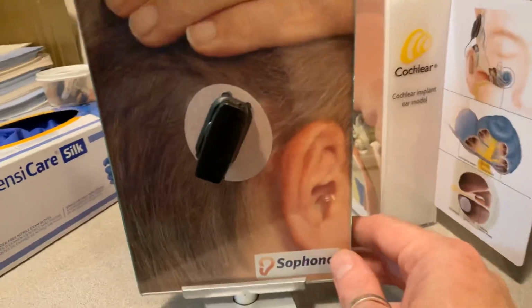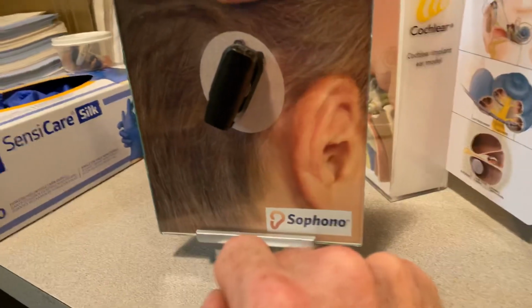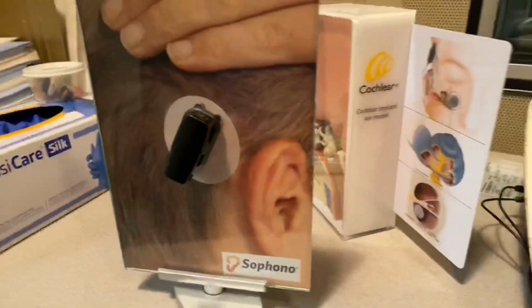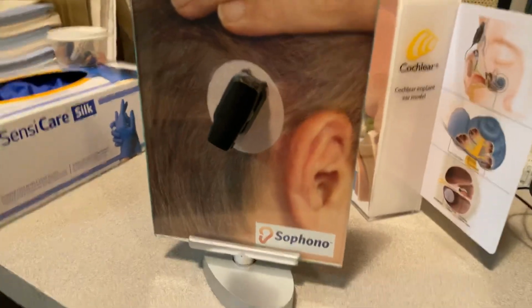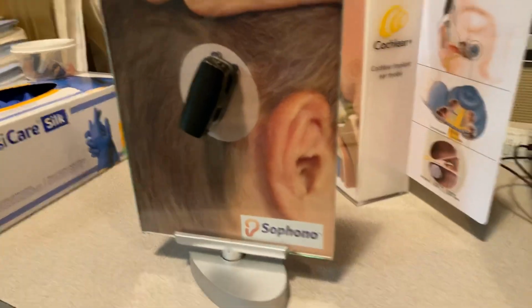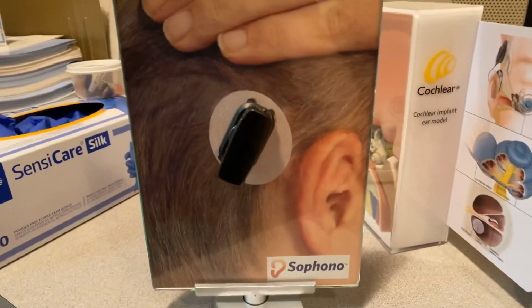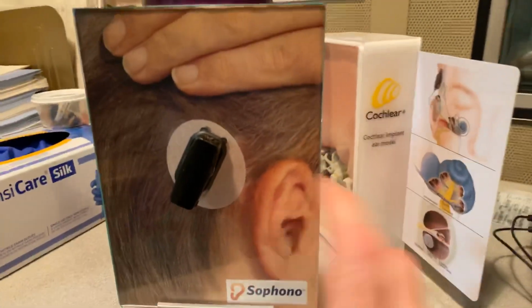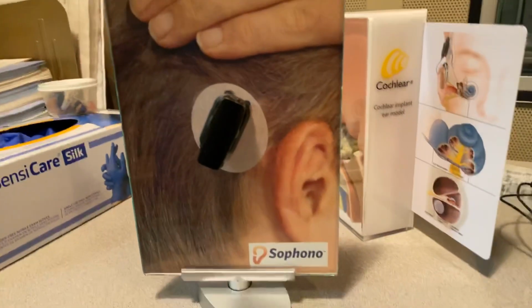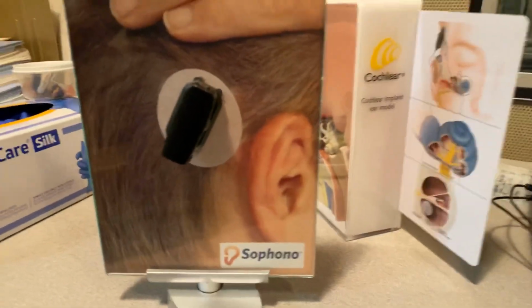We can then put the device on, and what a Baha, a bone-anchored hearing aid, does is bypass the outer and middle ear and stimulate the cochlea directly by sending vibratory energy right to the fluids and the membranes of the cochlea. In other words, if a person has a permanent conductive hearing loss and we have no way of getting the sound in through here via a hearing aid, a Baha is a good solution. Insurance pays for Bahas because they're surgically implanted. They tend to be a little less noticeable because, once this person lets their hair down, you don't see it.